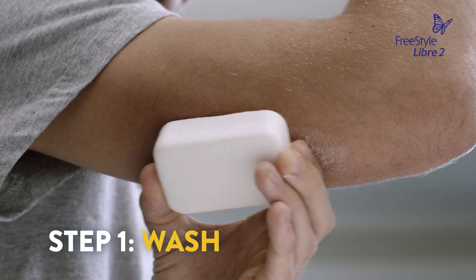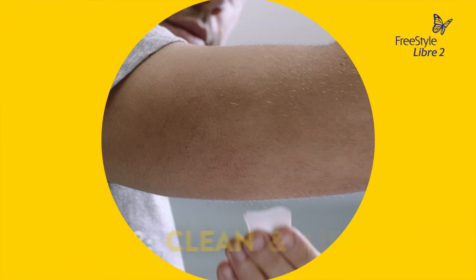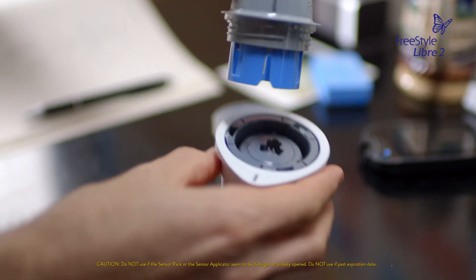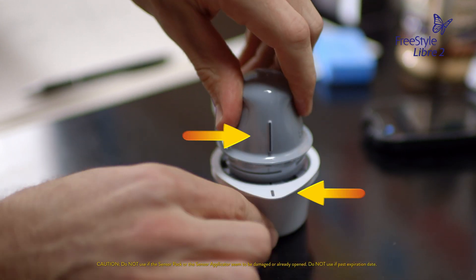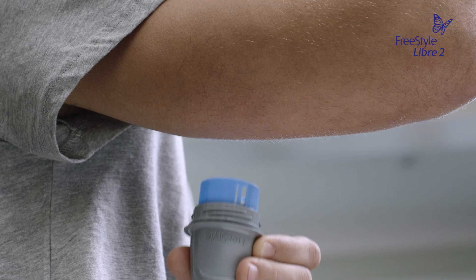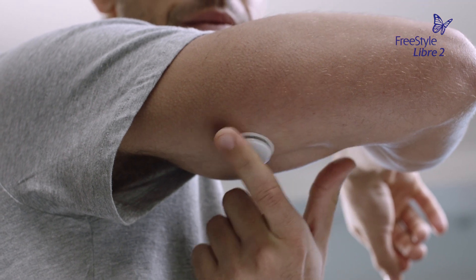To put on a new sensor, select a new site on the back of your upper arm, where you will clean it and let it dry. Then prepare the sensor pack and applicator the same way as instructed in the applying the sensor video. Then apply the sensor, and make sure the sensor is secure after application.